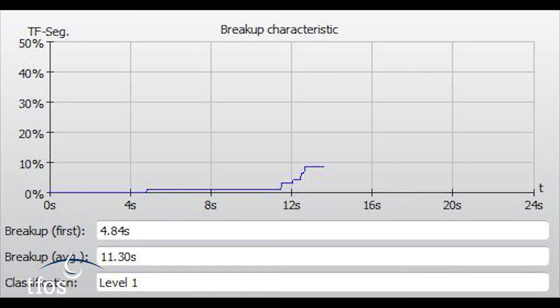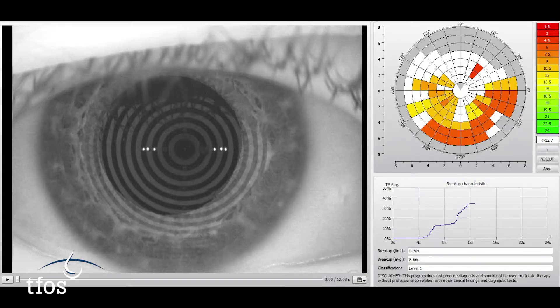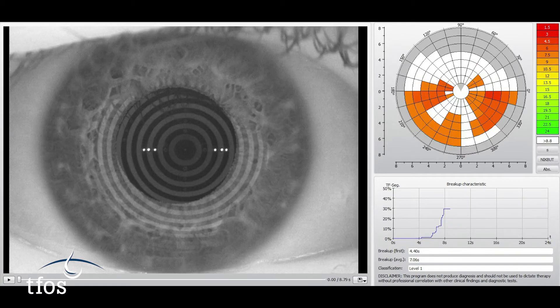A shallow gradient indicates gradual destabilisation of the film, whereas dry eye patients tend to exhibit a quicker break-up time with a steeper gradient.